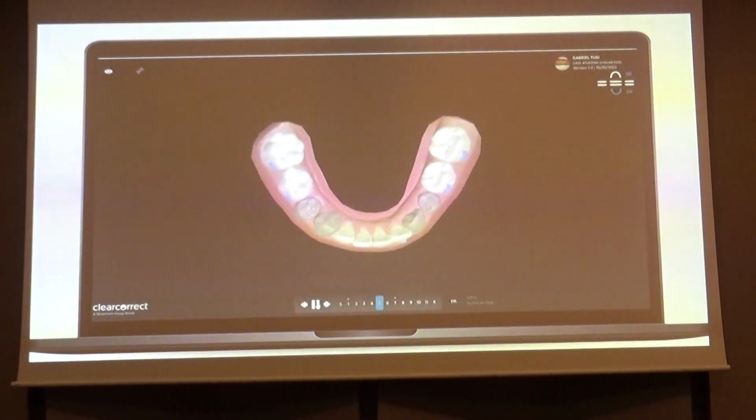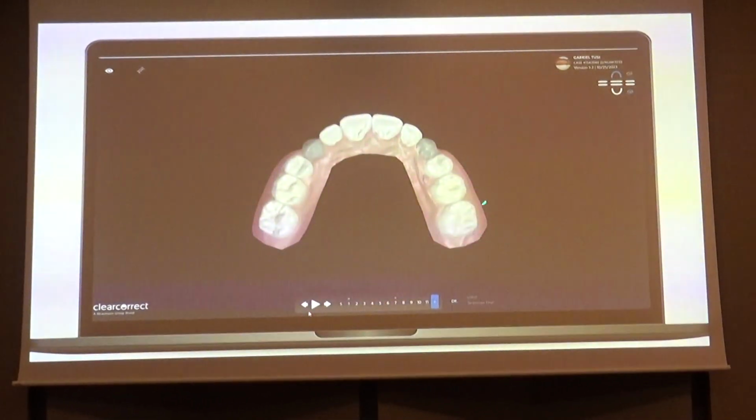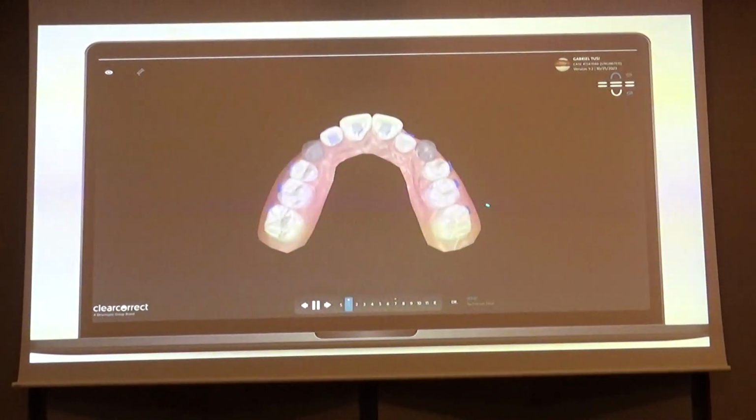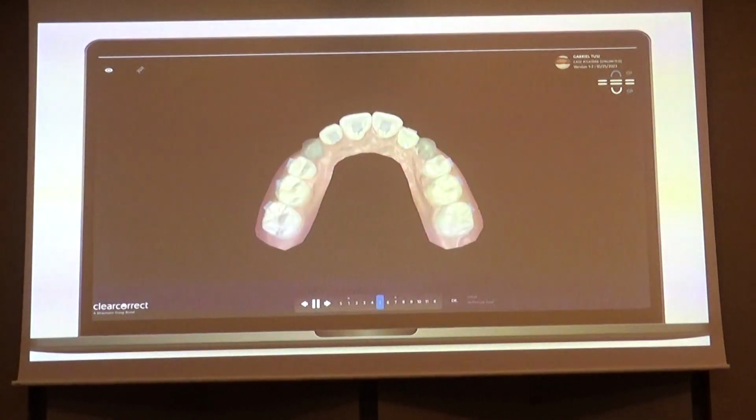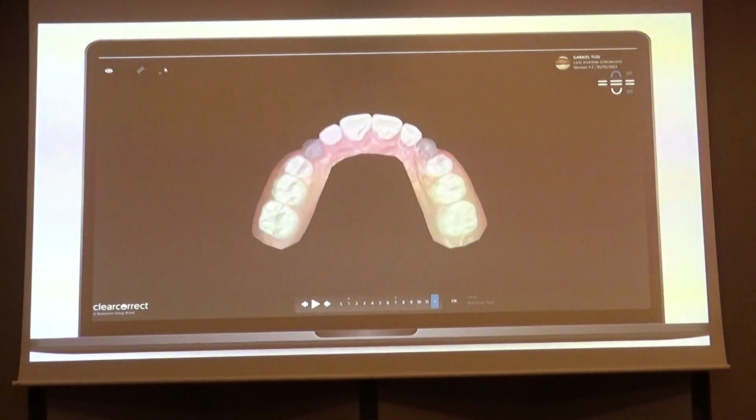Look, expansion. Engagers in the posterior teeth, that we're doing expansion, bite ramps in the anterior region. When we raise the bite posteriorly, we open the bite and allow the proclination of the incisors. And guides of eruption to allow the eruption of the canine.